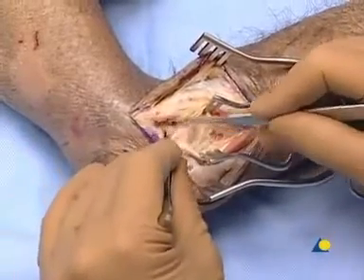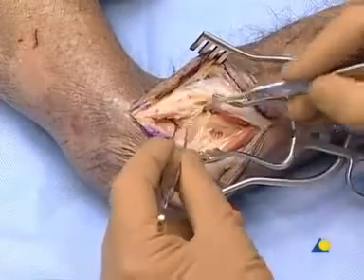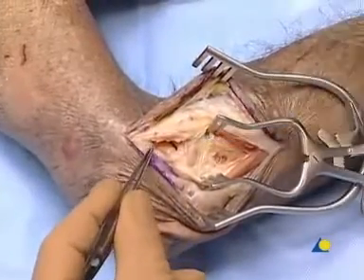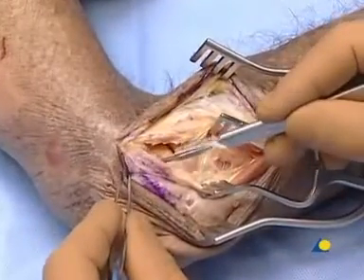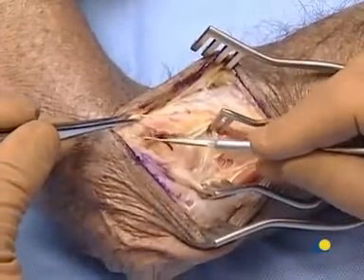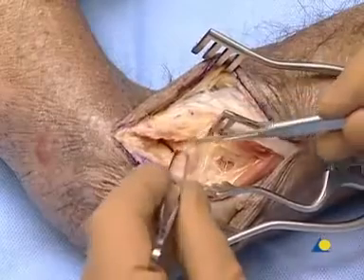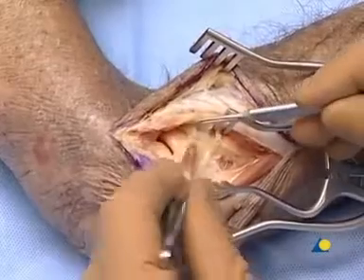The capitellum is visualized first — this is the front of the capitellum. The dissection should not be extended too far posteriorly from the capitellum. It is important to maintain the lateral collateral ligament, which runs posteriorly; removal of this attachment should be avoided if possible. The anterior insertion of the extensor muscles can be removed to obtain a better view of the joint surfaces. The annular ligament is incised, and the incision remains anterior to the equator of the radial head.